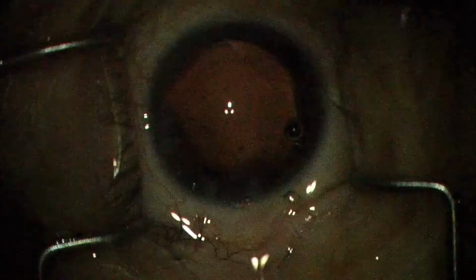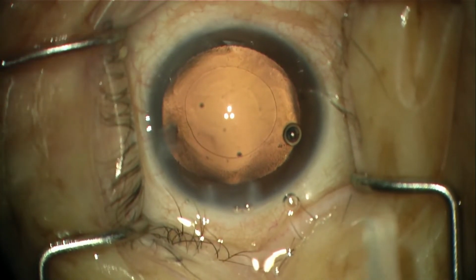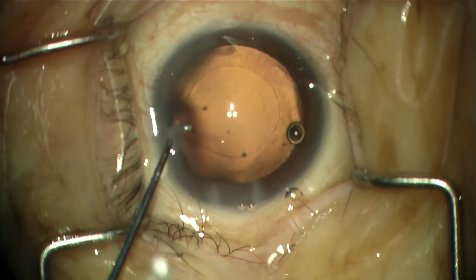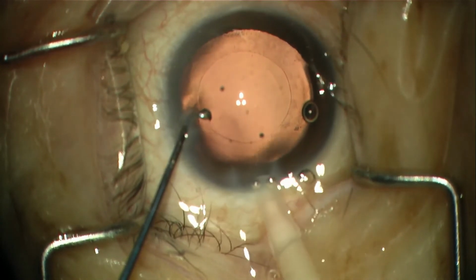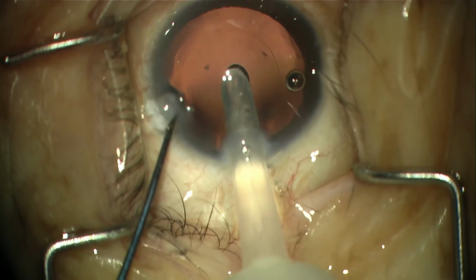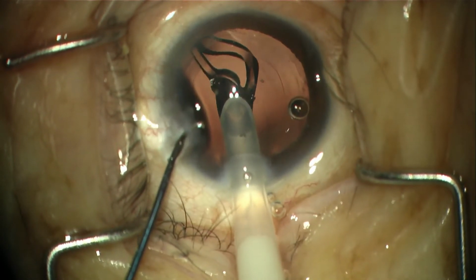So here we actually see the insertion of the Rayner RAO 600C intraocular lens. And so this is inserted in one step directly into the capsular bag and unfolds very nicely. This lens is made in England and comes from the company that made the world's first intraocular lens.